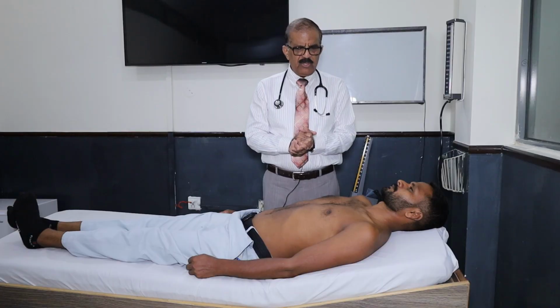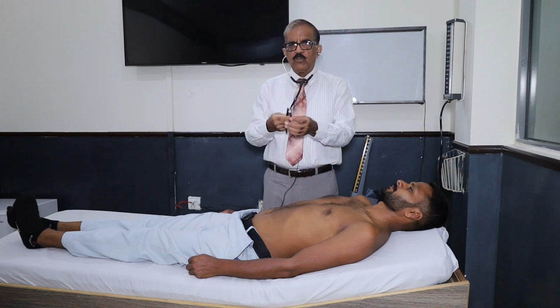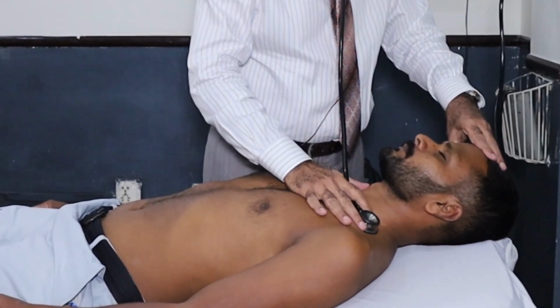Today we are going to start the examination of the respiratory system. Let me now demonstrate the method of auscultation. So you use your stethoscope, and most of the auscultation of the lung is done with the diaphragm, and I may start from here. Deep breath.